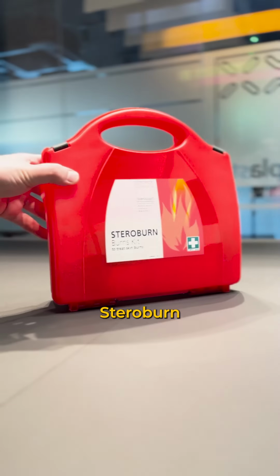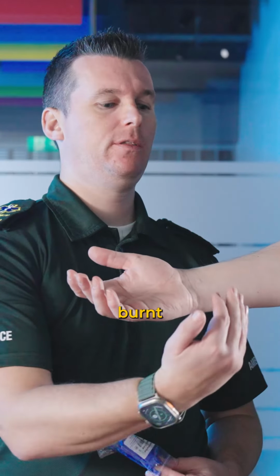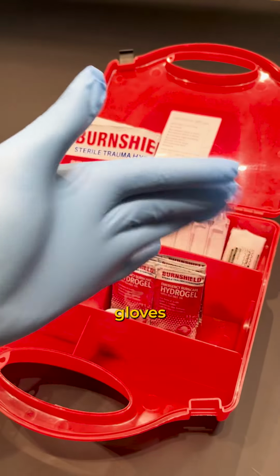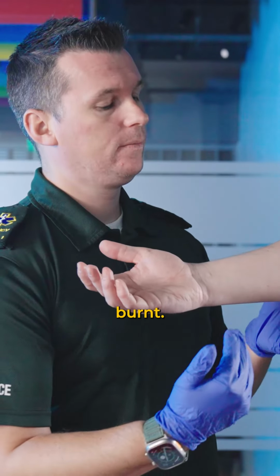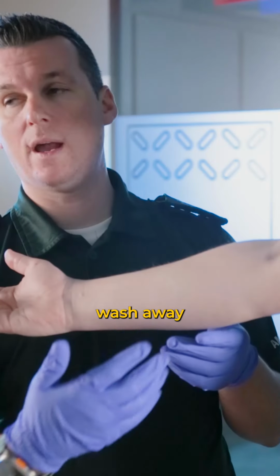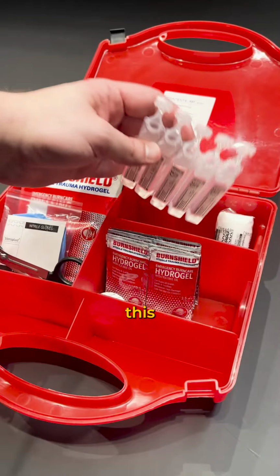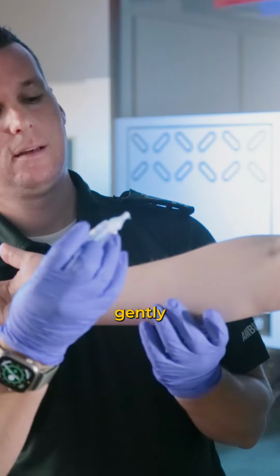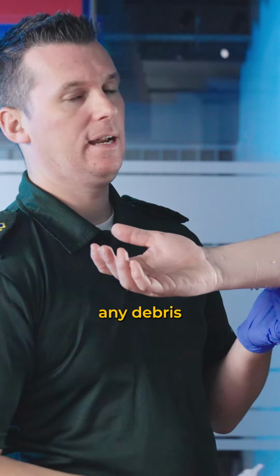Here's how to use the Steroburn Burn Kit. This person has burnt their forearm. The first thing we're going to do is put on our nitrile gloves. Inspect the area that they've burnt. If we need to wash away any contaminants, we can do this using the sterile pods. Twist off the cap off one of the pods and gently irrigate the area to clean any debris.